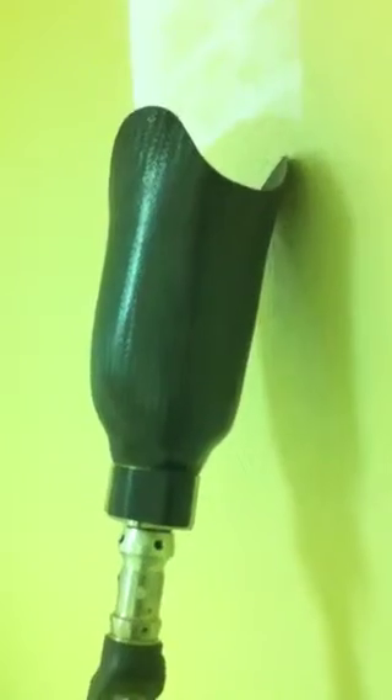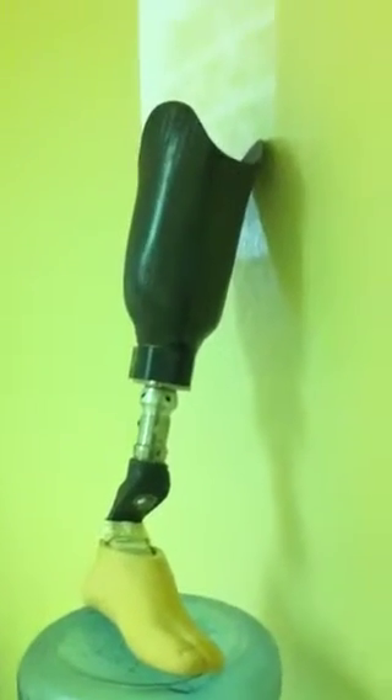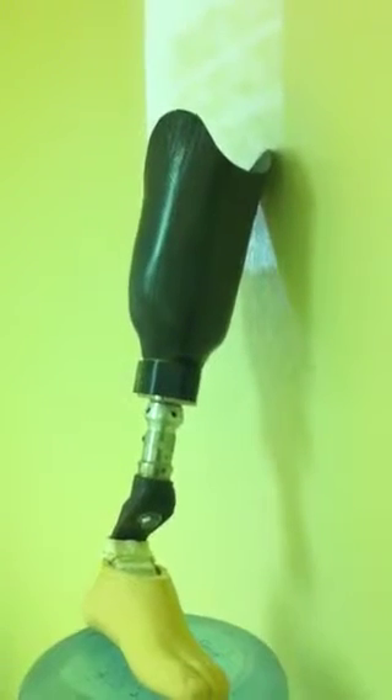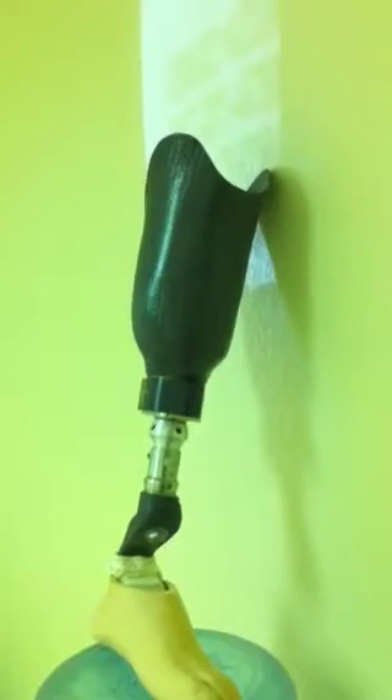The vacuum pump would have a sealing liner that would go from about here up to mid thigh on the patient, and that would create a seal across here. Then all the vacuum would be pulled out of this, so he would have a negative pressure inside the socket, and that in itself would help with an increase of circulation.